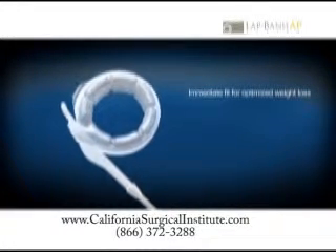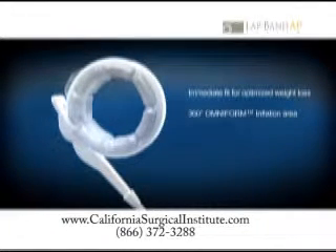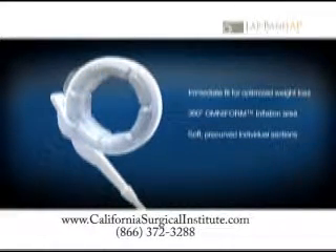Omniform Inflation provides 360 degrees of pressure evenly delivered throughout the band for complete stomach coverage. Soft and flexible pre-curved individual sections help minimize the potential for leaks from creases and folds.